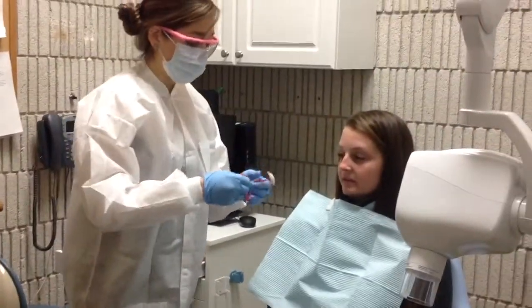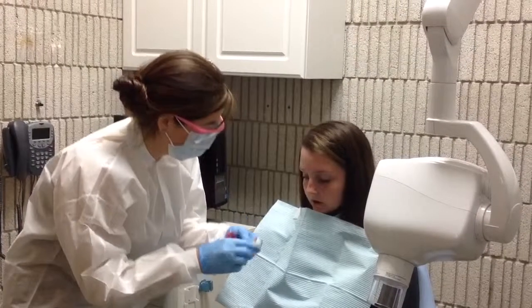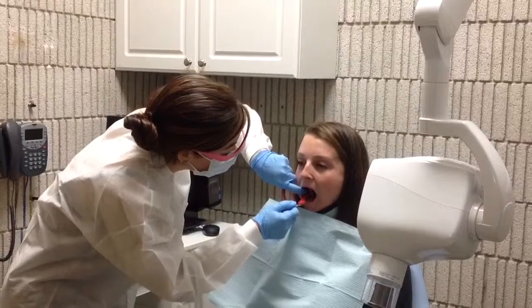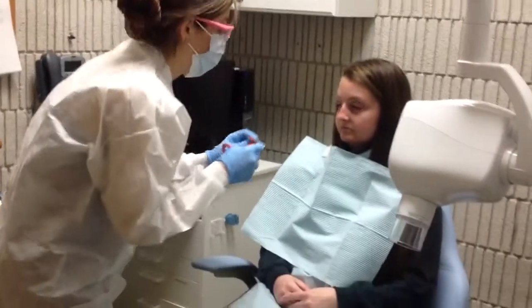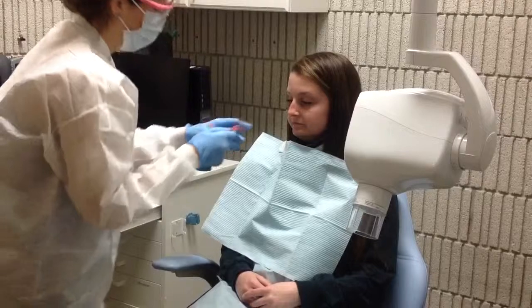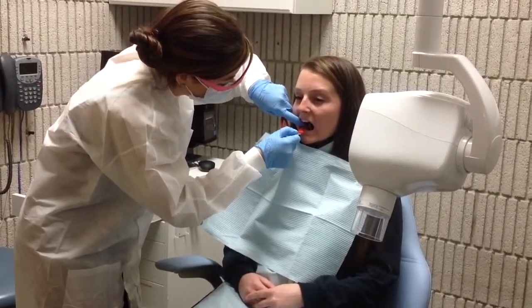Okay. So remember, I'm going to have you bite down right here, and this is going to go in between your tongue and your teeth. Okay. All right. Have you open nice and big. All right. So we're going to try it again, okay? I need you to listen to my directions. You're going to breathe in and out of your nose. Okay. All right, and slowly bite.